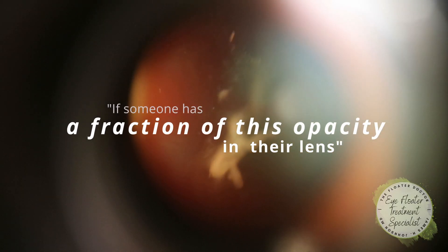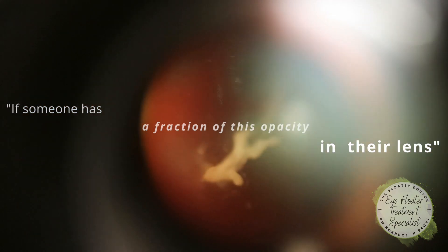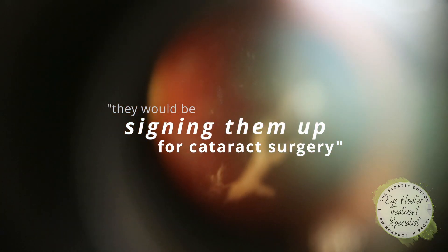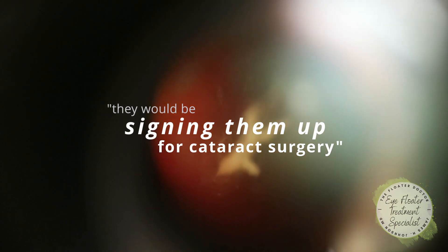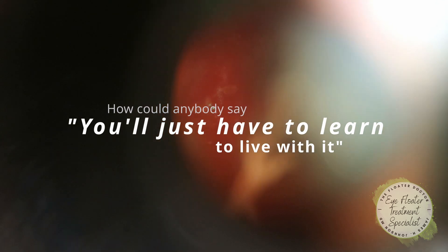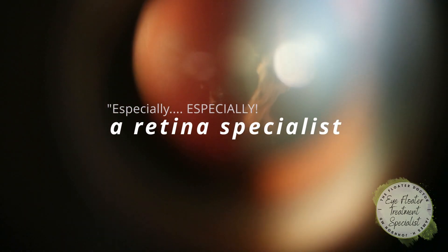If somebody had a fraction of this degree of opacity in their lens, they would be signing them up for cataract surgery and upselling them to a multifocal lens. Seriously, how could anybody look at this and say 'I just have to learn to live with it,' especially a retina specialist?